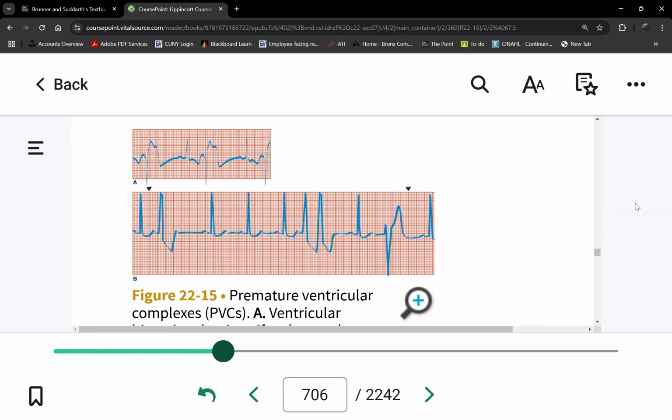Let's go back to PAC. How do we recognize that there's a PAC? What do we see? A pause, right? So here you have a pause again. And you look at the wave immediately preceding it. That's a premature beat. So this is your underlying rhythm. This is your normal rhythm, normal sinus actually. But this is the distance between each contraction. This one, is it the same distance? No, it occurred prematurely. So after a premature beat, it's always followed by a short pause and then it goes back.